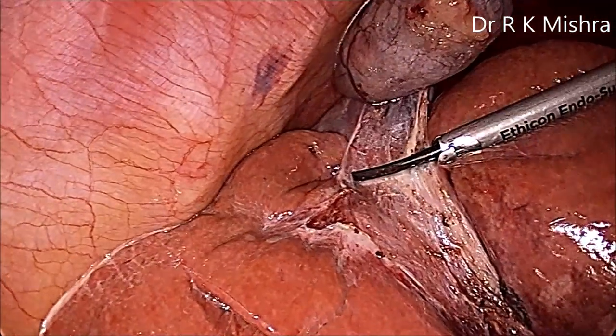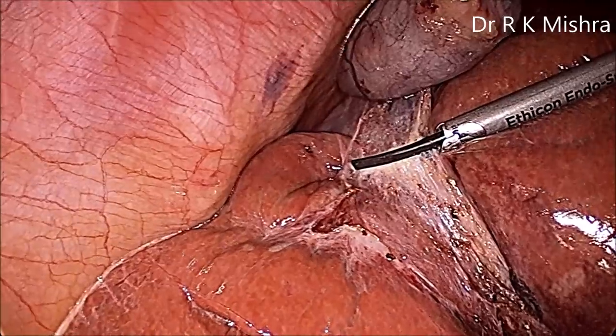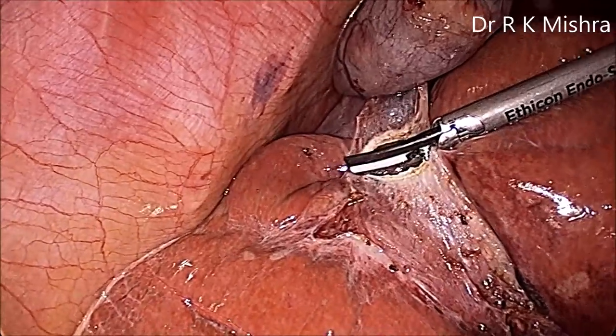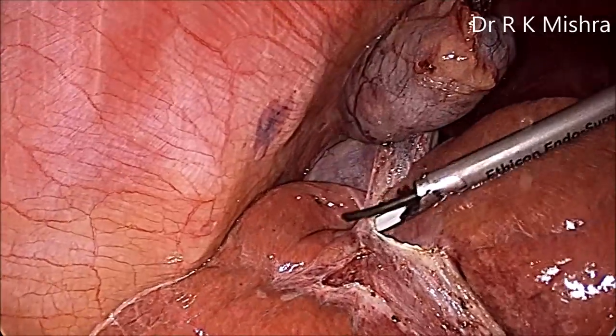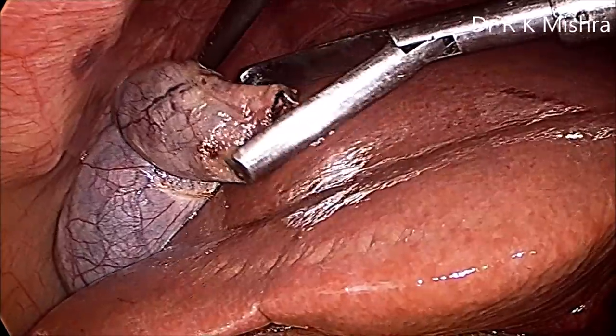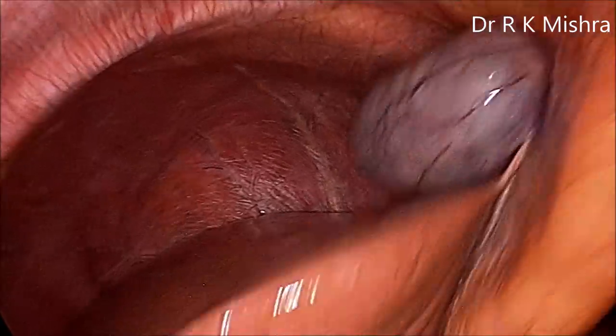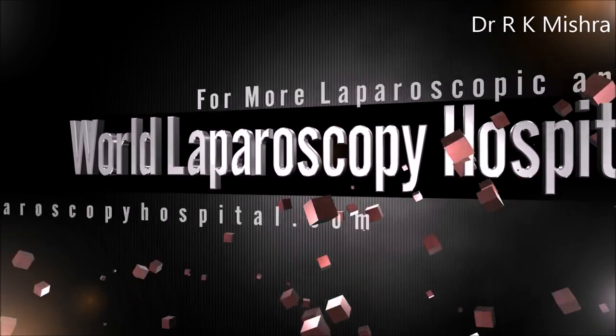Laparoscopic cholecystectomy is very easy to perform in a systematic manner. Using the ICG injection before surgery gives a fantastic result and you can see the clear biliary anatomy. The gallbladder has been held by claw forceps and taken out from the epigastric port. Thank you very much for watching this video — have a nice day, God bless you.